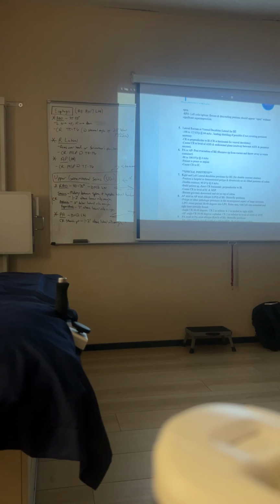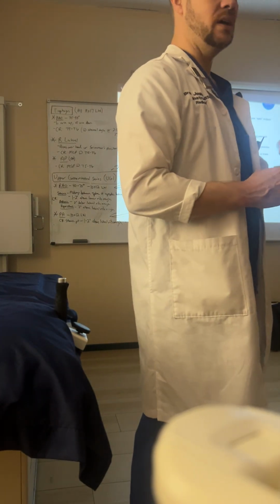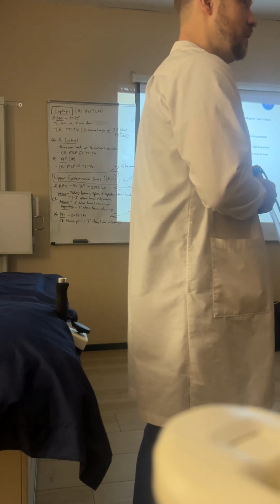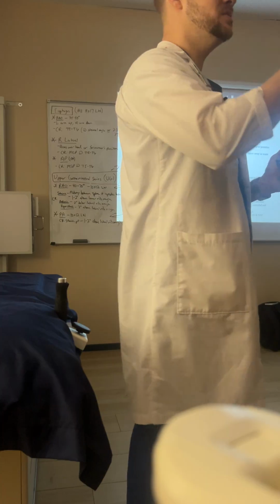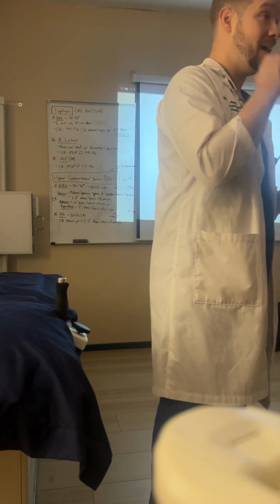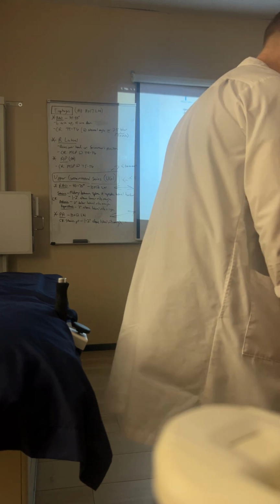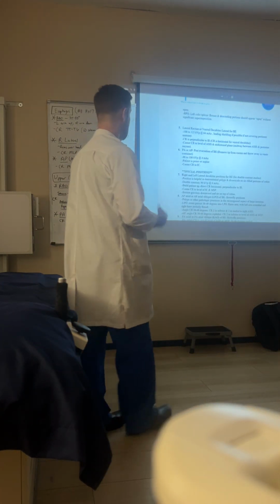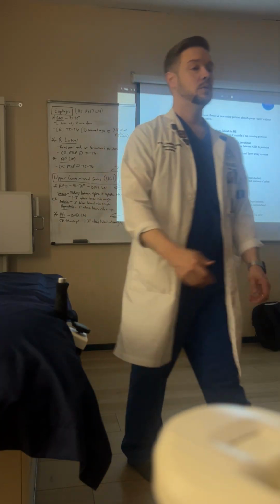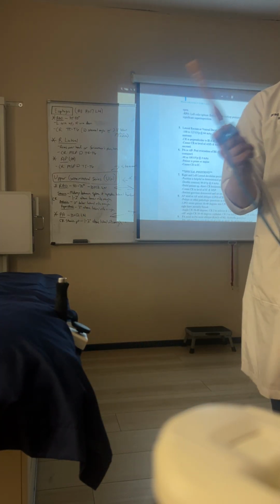What does that mean? So after the procedure is done, the radiologist has done his fluoroscopy, we've gotten our overhead images. Mind you, the whole time that we're taking our overheads, the patient is still full of this barium. So what is very important? Efficiency. We need to be very accurate with our imaging, okay? Because the whole time they're going to be on the table, okay? Lying on their back. So we need to be quick about what we do. Once we're done, this tip is still going to be in the patient.